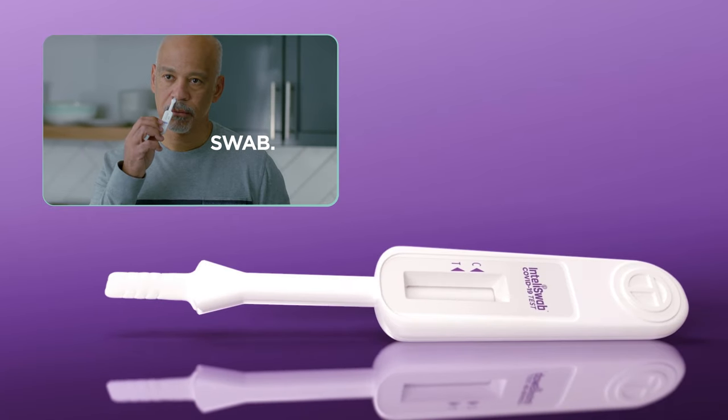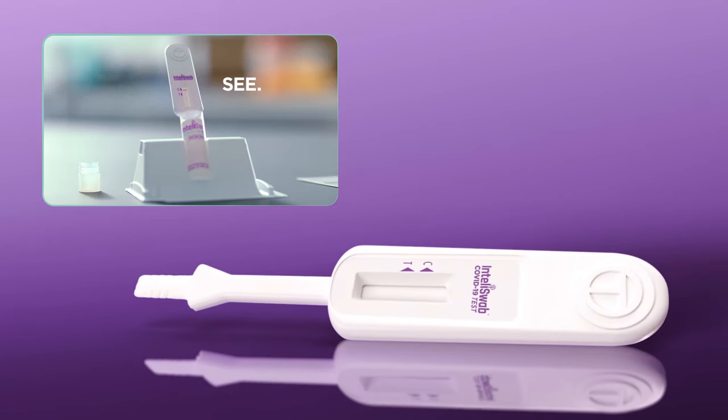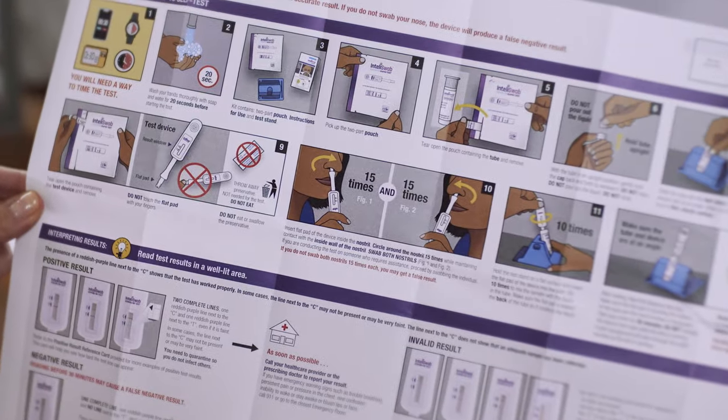This video will take you step-by-step through the simple test process, but be sure to read the enclosed instructions fully before performing your test.